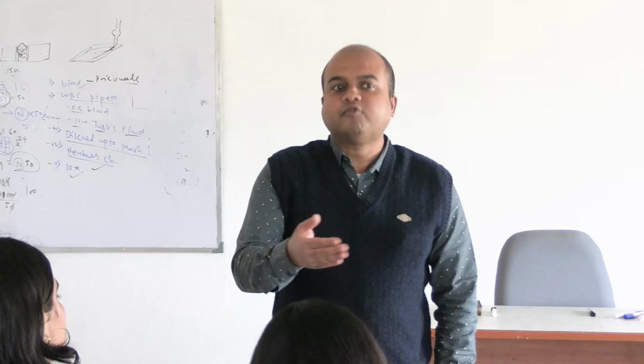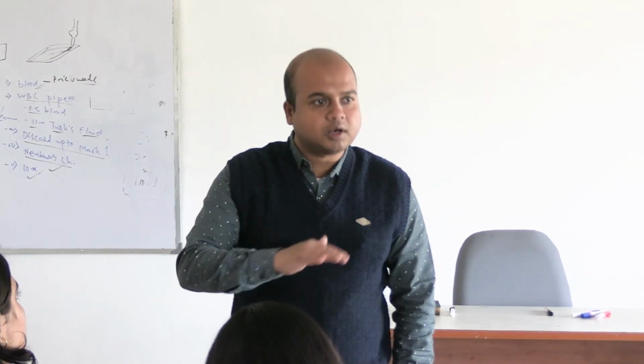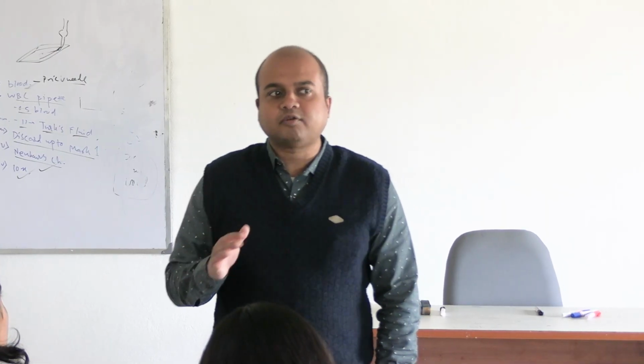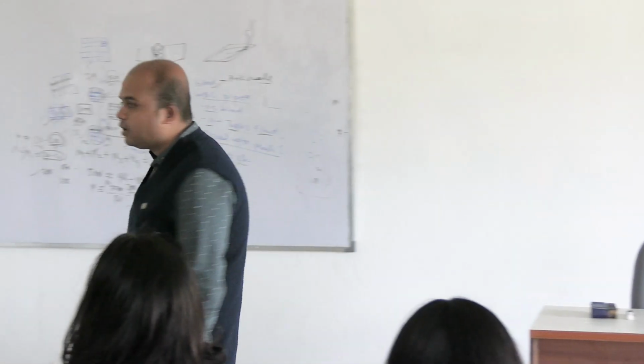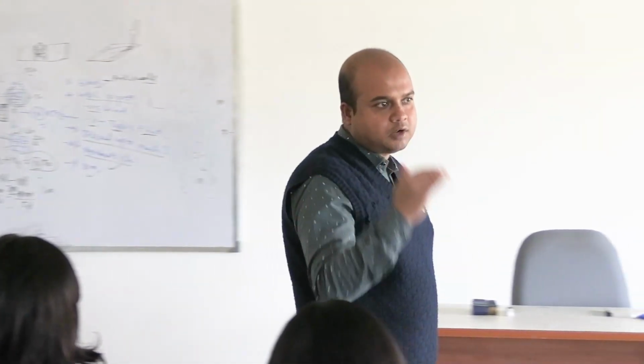In the books it is written volume of the squares, but very strictly speaking it is not the volume of the squares. Squares are on a surface, you may imagine it to be 2-dimensional, like there can be an area of this room but not of the floor or the roof. It has to be a 3-dimensional space for us to talk about a volume. So, strictly speaking we should say volume of blood overlying the squares after uniform distribution.